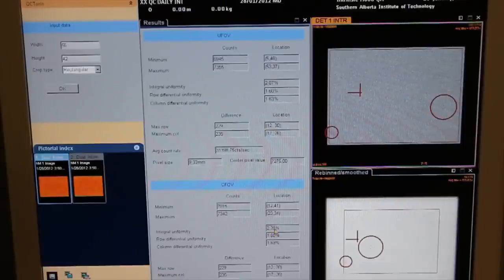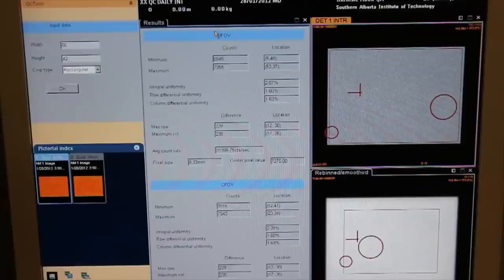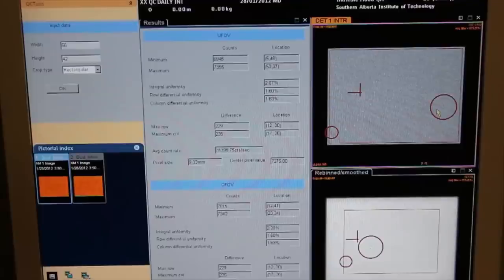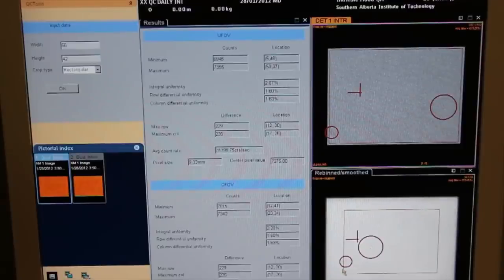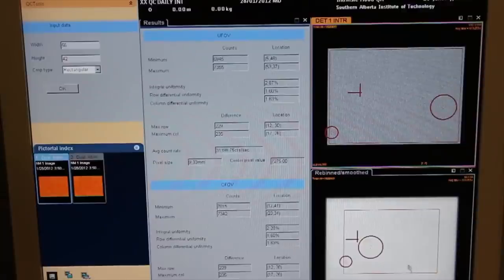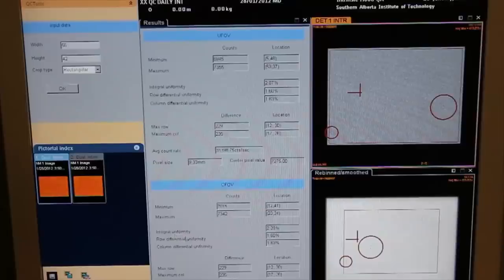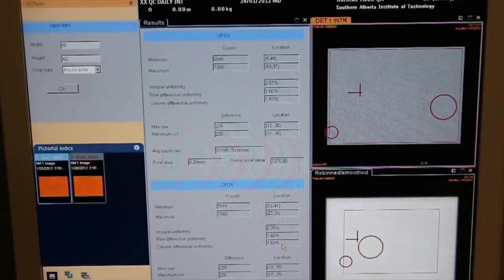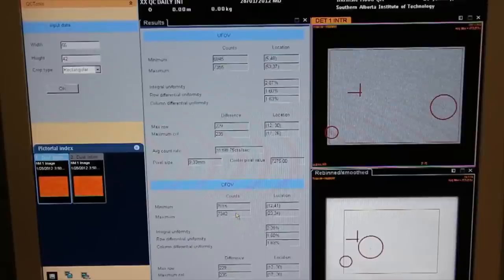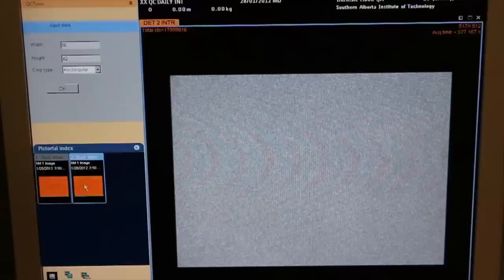Obtain the quantitative uniformity analysis for a useful field of view and central field of view. We see that the software identified areas of higher and lower counts within the field of view. Note the integral and differential values.